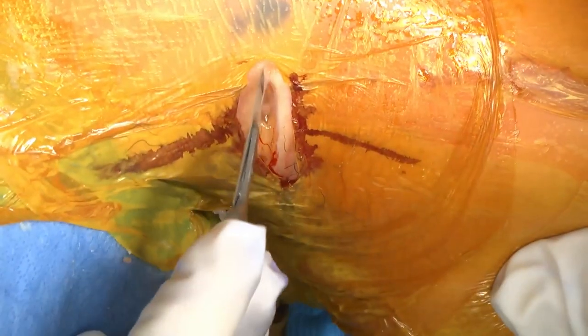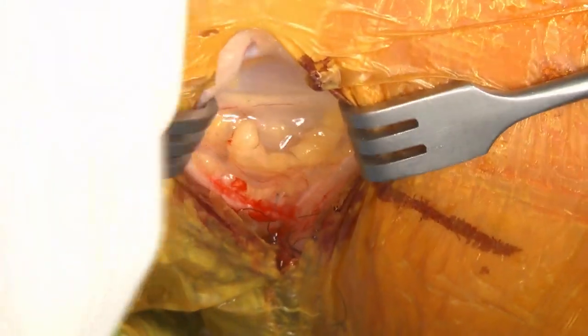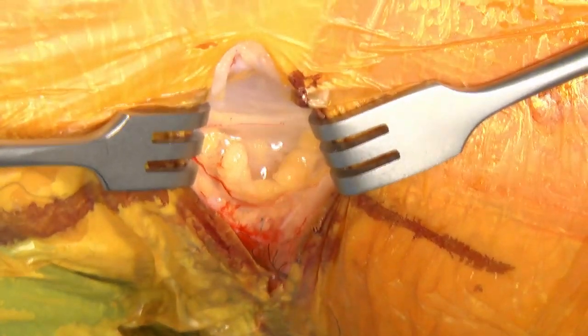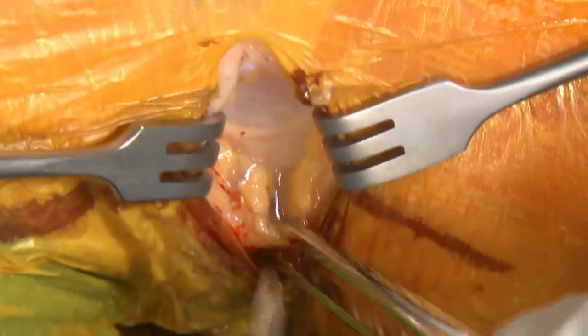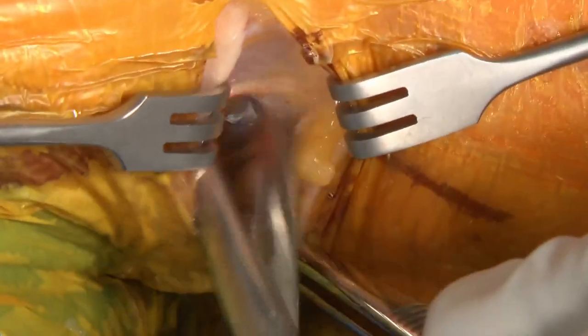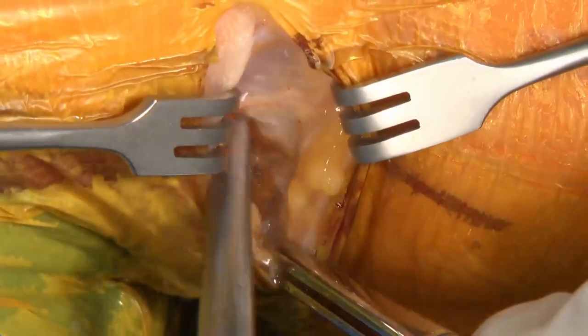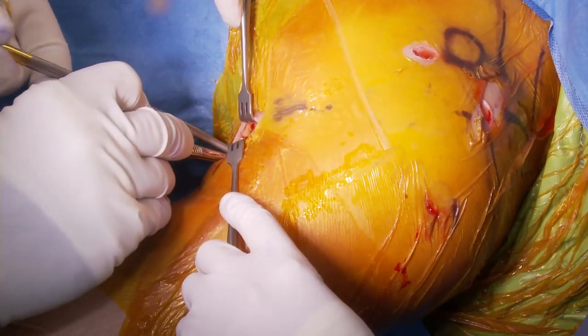Okay, Metz, please. Take that. Just hold it there. So we come right down on the pec. What we do is we actually aim to the lower part of the pec. And let's have an Army Navy, please. We get into a fascial plane right here, which is at the lower part of the pec, and the biceps tendon runs immediately underneath that in this region.